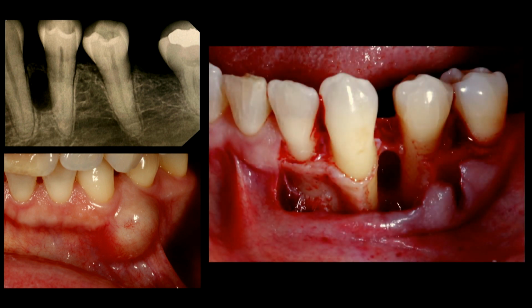Here's another case, very similar, but a little different. This one actually turned out to be an odontogenic keratocyst. Very high rate of recurrence, but the procedure in itself was the same. We flapped the site open, we curetted very well. That's very important, to completely remove any epithelial lining. We planed the teeth, but look at the difference in the defect here. So I was really missing quite a bit of bone there.